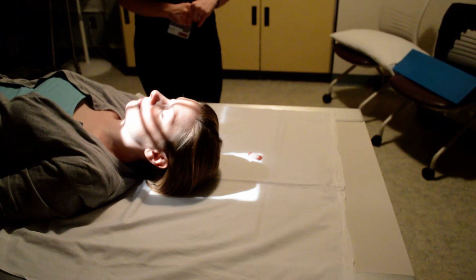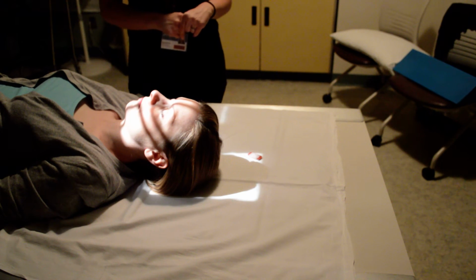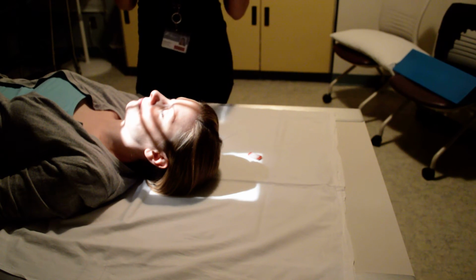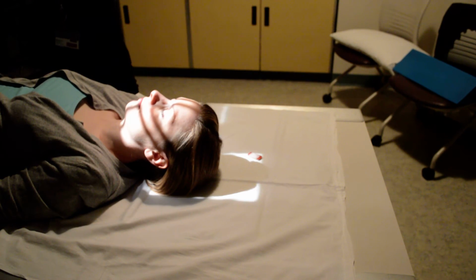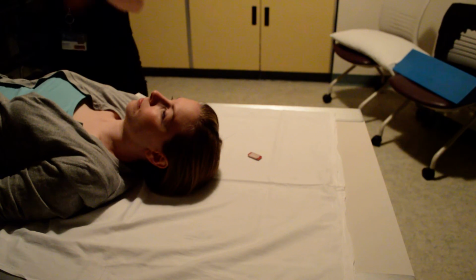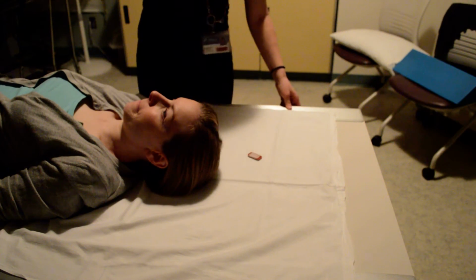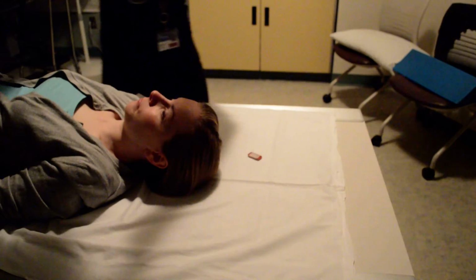And then the next one that we're going to do from this is going to be our exaggerated Towne's, which is for the mandible. So for this one, we use a 35 degree caudal tube tilt. So I already have my SID at the 35 degree line. I'm just going to reverse what my tube tilt is and go in the other direction. Bring my tube down to the head of the table.